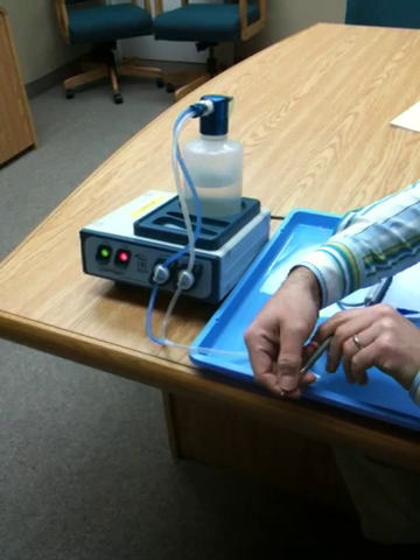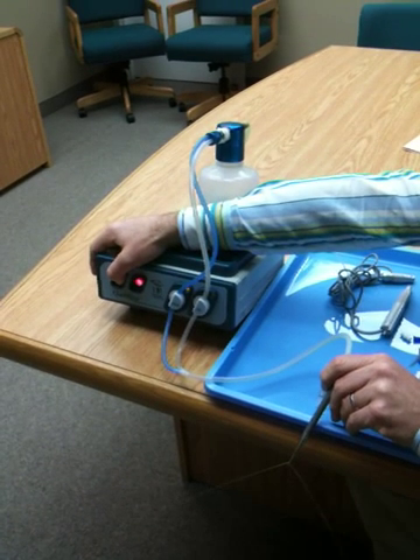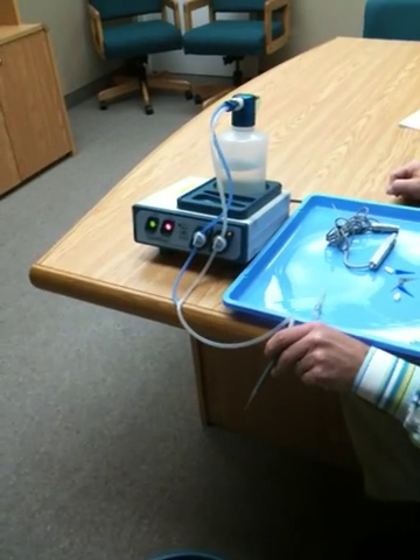Otherwise you're going to get fluid backing up, so we would recommend one or two seconds depending on the size of the gauge of the opening.